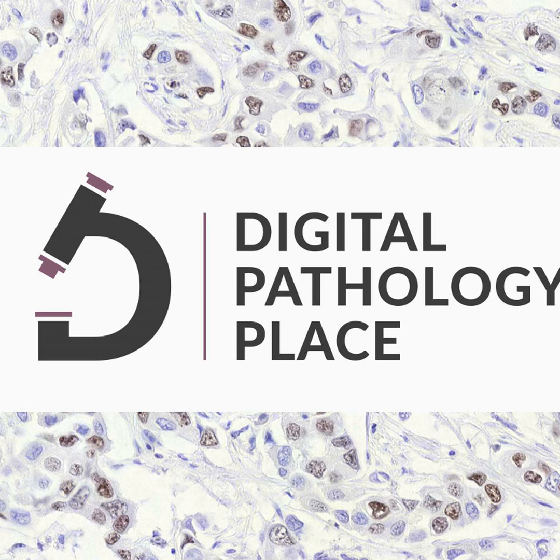In conclusion, reading mammograms with AI significantly enhances the detection of early cancerous changes in dense breast tissues, and the AI detection rate does not correlate with specific pathology types of breast cancer, highlighting its broad utility. The AI just detects cancer and not a specific type, so basically it flags, and then you can do whatever diagnostic workup is necessary later. And subtle mammographic changes not corroborated by ultrasound but marked by AI warrant further evaluation. So if AI marks something, you try to evaluate it.